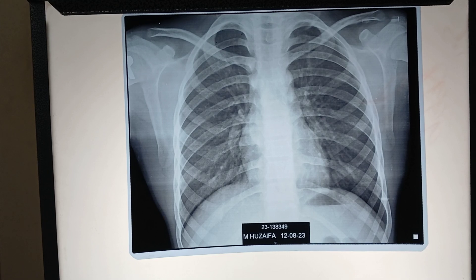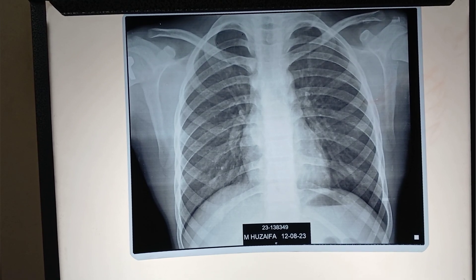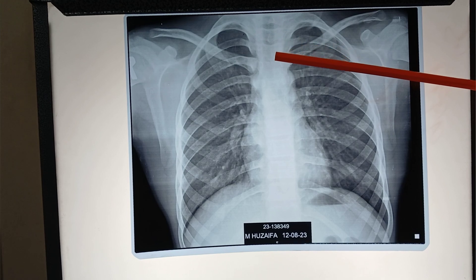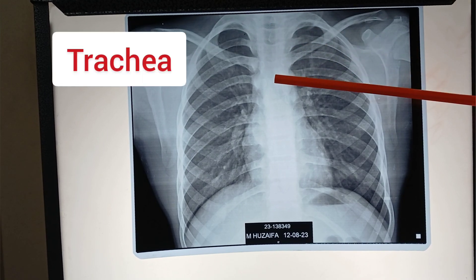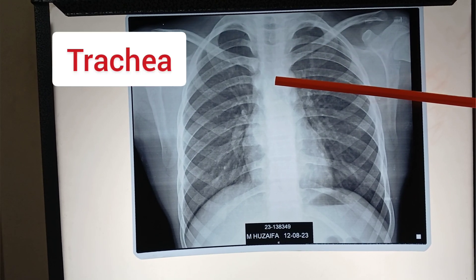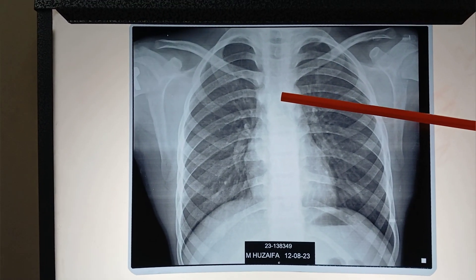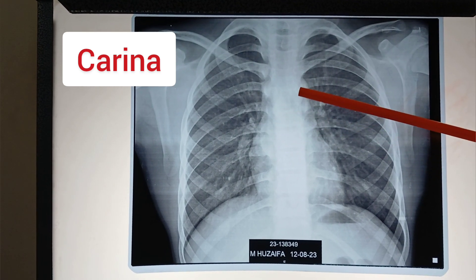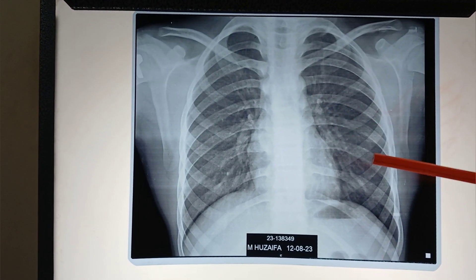Now I will tell you structures which are seen on X-ray. This central lucent line is of the trachea. Here, its dividing point is known as the carina. This is the right main bronchus and this is the left main bronchus.